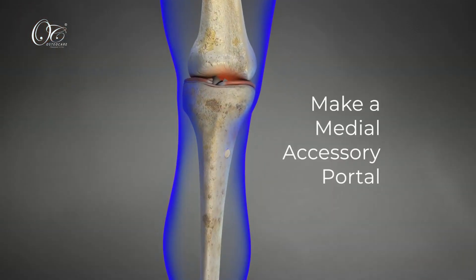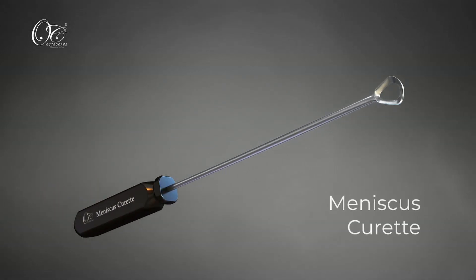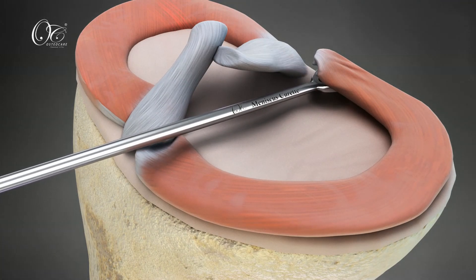Make a medial accessory portal anteromedial to the tibial tunnel. Debride the tibial cartilage with a meniscus curette and prepare the bed through exposure to subchondral bone. The subchondral bone serves as the biological bed for healing, prepared with the help of the meniscus curette.